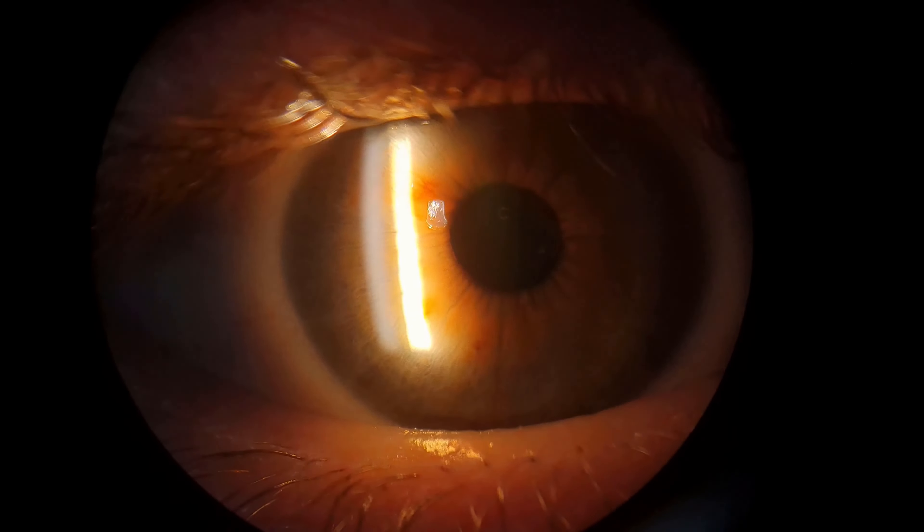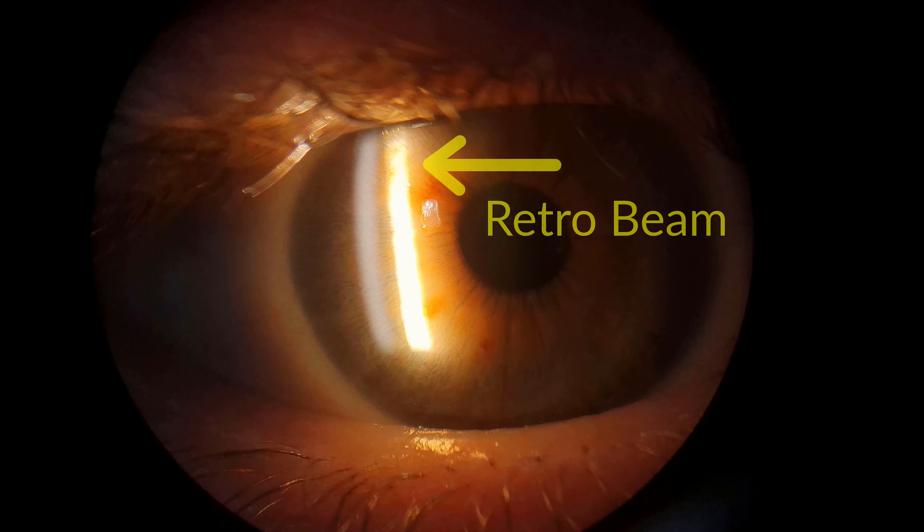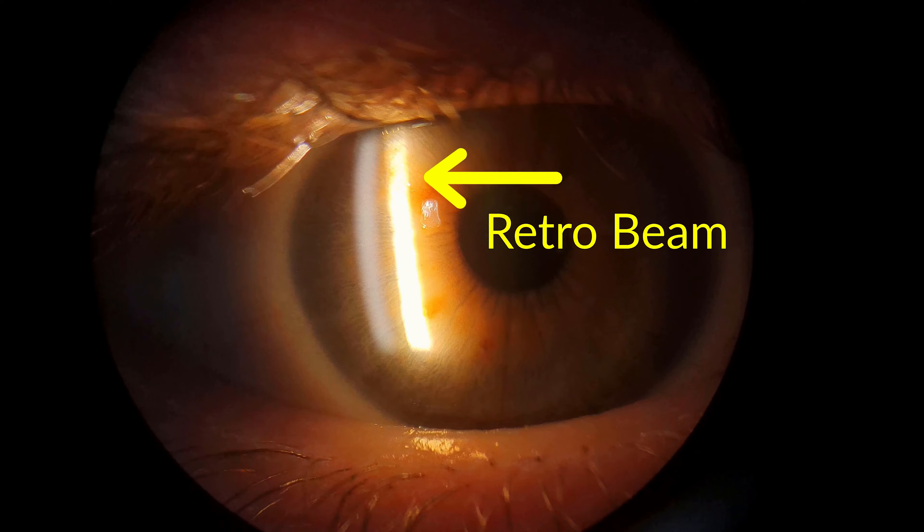Next is the Retroillumination technique. It uses reflected light to illuminate other areas from behind. You can reflect light from the iris or the retina. To use the iris to retroilluminate, use a tall, moderately bright slit beam and angle the illumination arm. This can be helpful to detect fine corneal changes.